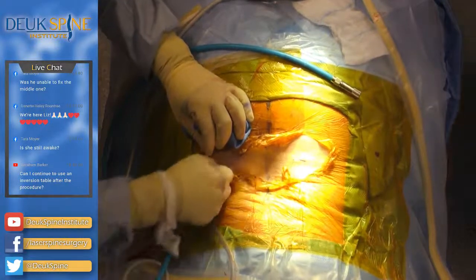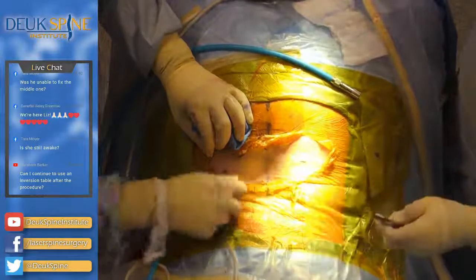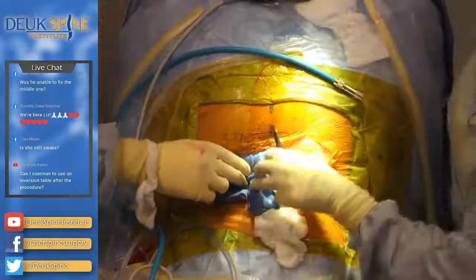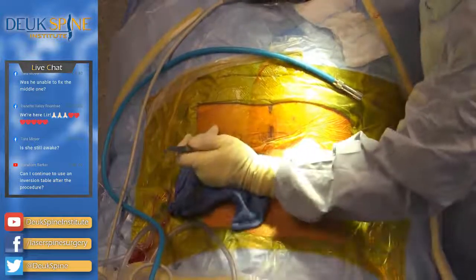All right, so she had 2 incisions, both 7 millimeters. Beautiful. Just put pressure for 1 more minute and you're good. Thank you. Everybody, thank you. Great work.